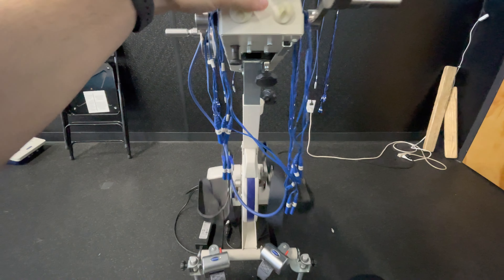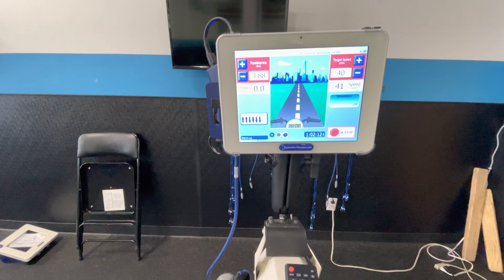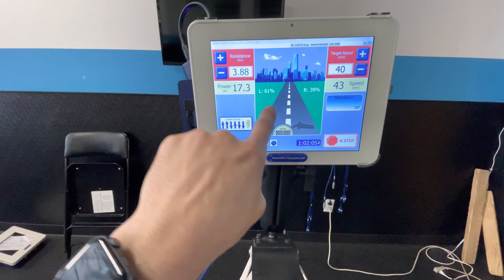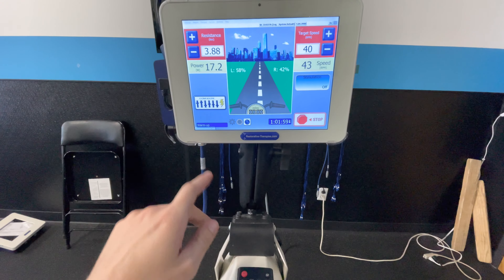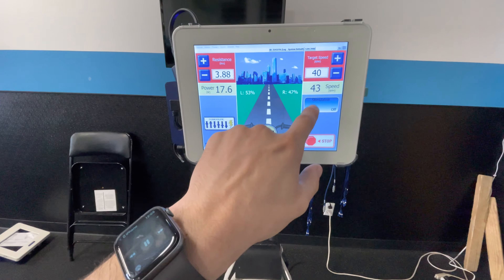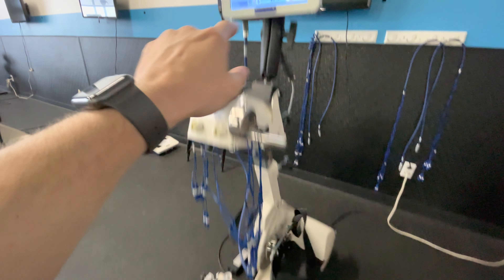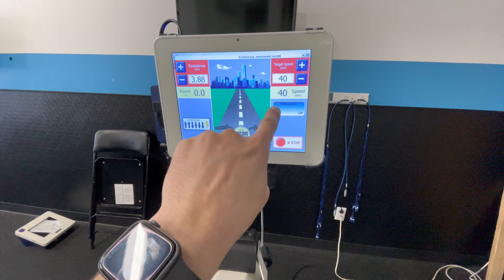As I put my feet into the holsters and start pressing into the bike, you can see watts starting to appear. You can also see a left-right asymmetry and my speed increasing. When I'm actively pressing, there's an active wattage output and my RPM goes higher than when the motor is running alone. When I remove my feet, the wheels continue spinning in warm-up mode with no power output, providing passive range of motion.